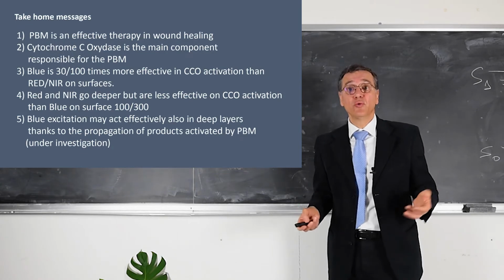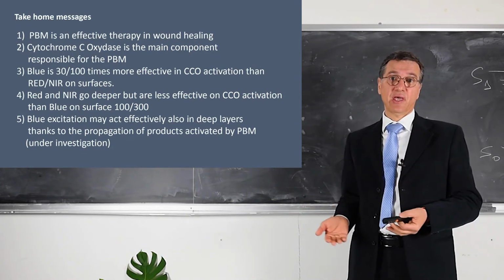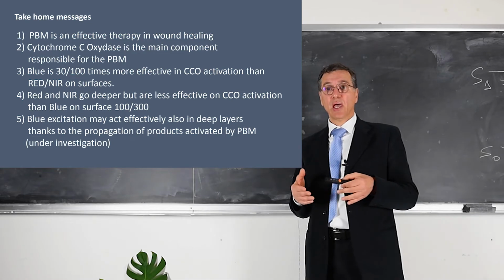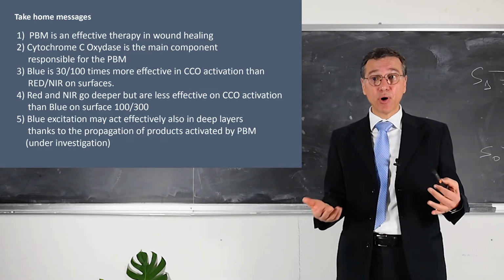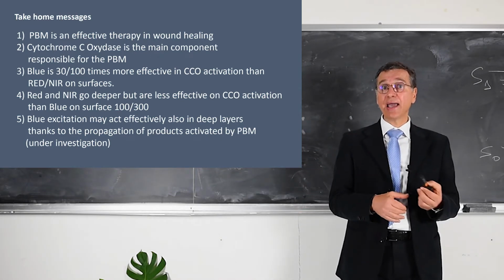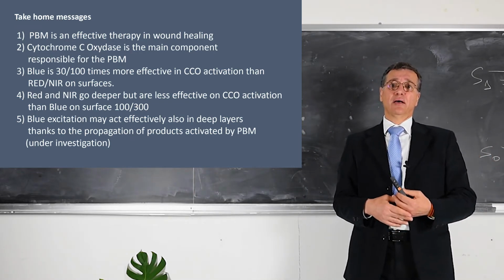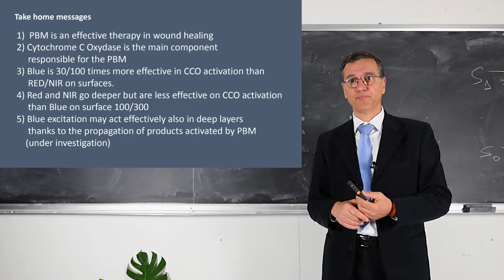So, to conclude, we can say that for sure photobiomodulation works. It works with red, it works with the near infrared, it works with blue. We can say that the cytochrome oxidase is the main component which is excited by the light and which produces all the components and the signaling pathways that are going to produce the healing process.